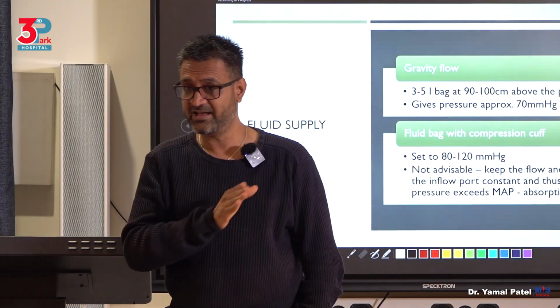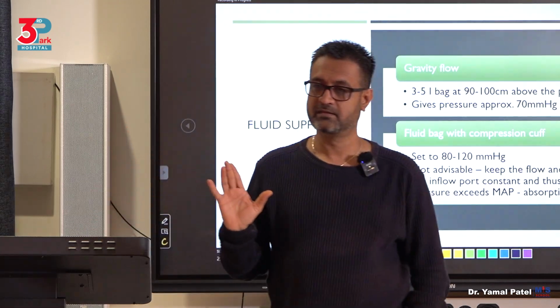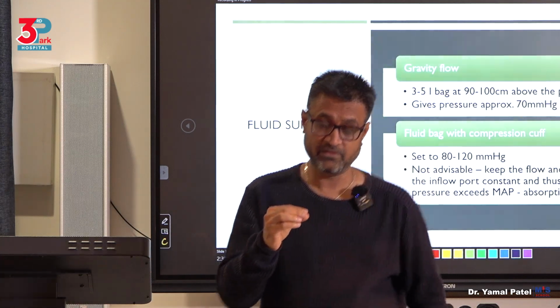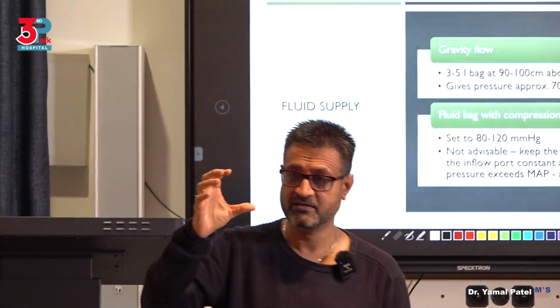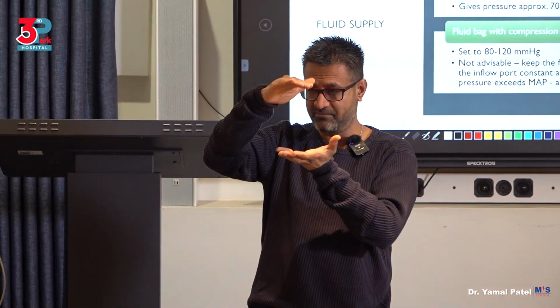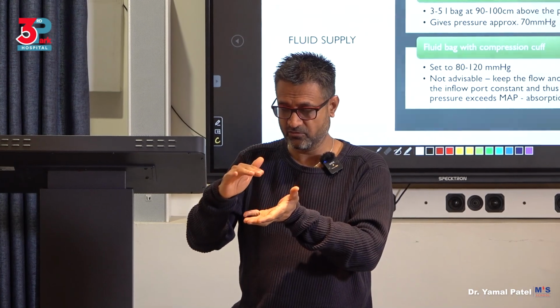Constant pressure, variable flow hysteroscopy. Okay? So what does that mean? At any given time, if you've put your setting at 70, or 100, you want your pressure always to remain below 100. You've understood.